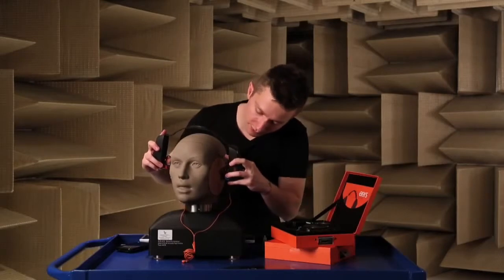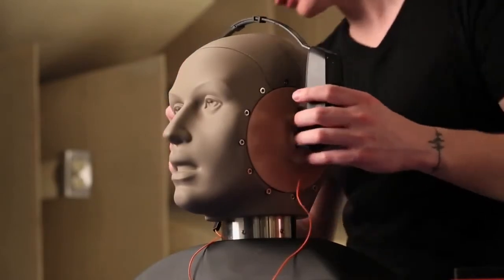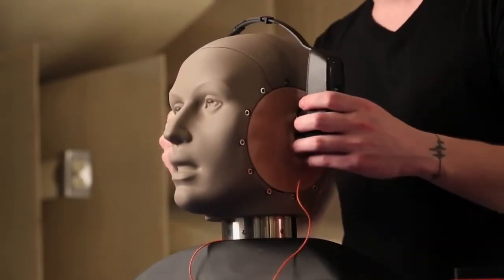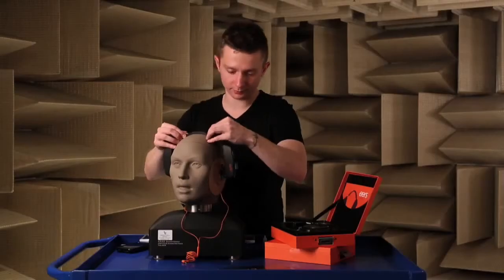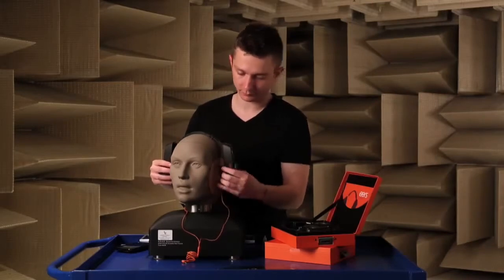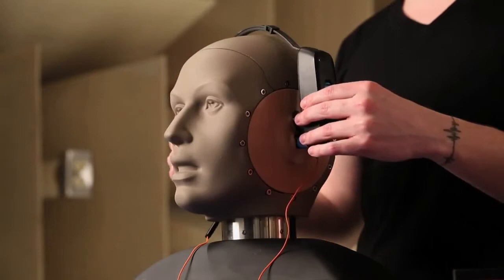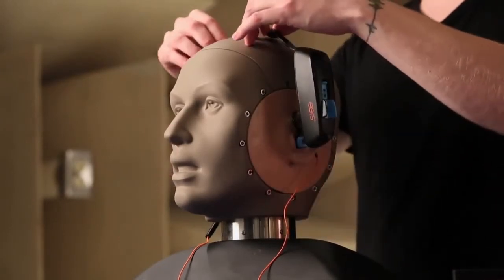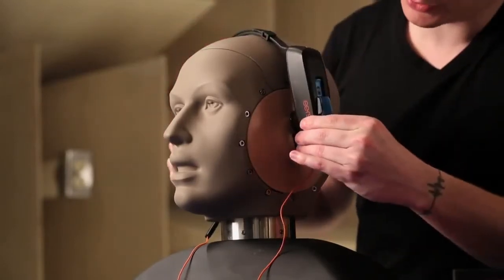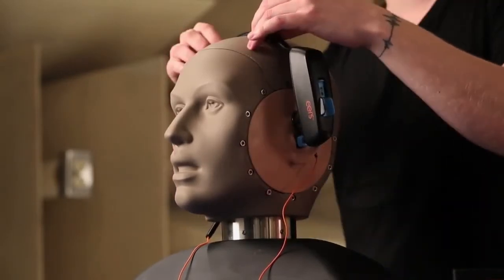Insert the earpiece into the center of your ear canal. Loop the ear hooks behind your ear and adjust the headband snug to your head. Make sure that the headband stays vertically centered, not leaning forward or leaning back — vertically centered, snug. Give the earpieces a final wiggle to make sure that they're deeply inserted into the ear canal and that they feel comfortable and symmetrical on both sides.